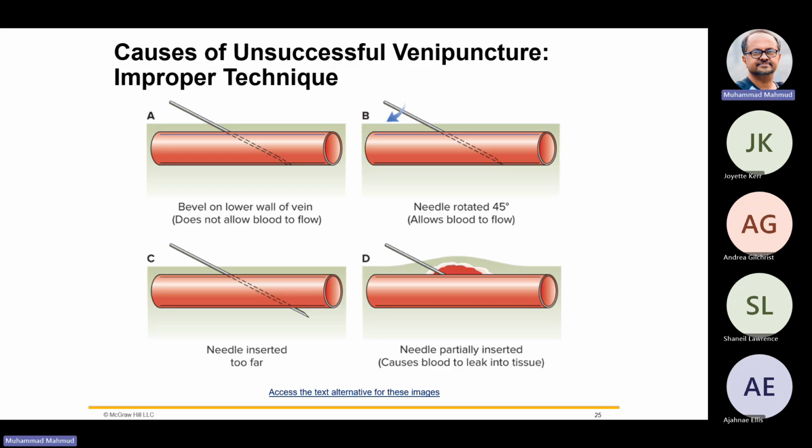Advance the needle a little farther into the vein in case the needle has not fully penetrated into the vein. And do this only if the vein is not yet punctured and a hematoma is not forming. Try releasing the tourniquet slightly to improve blood flow. Remember, never probe the site with a needle.